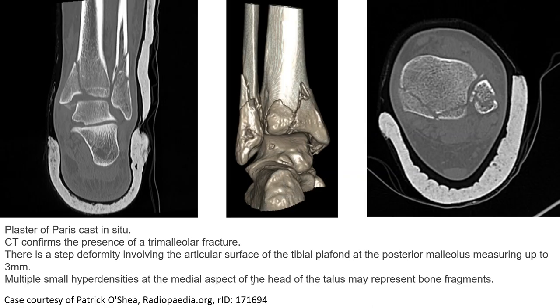And another case before finishing: this is also a case of trimalleolar fractures, where we can see the fracture line going across the medial malleolus, lateral malleolus, and the posterior malleolus, as shown in the 3D image and the coronal image of the CT of the ankle.